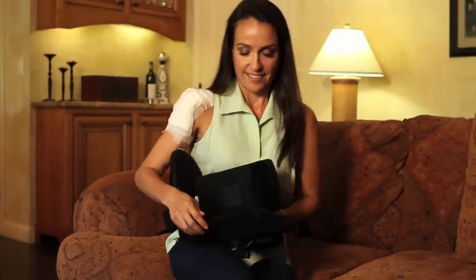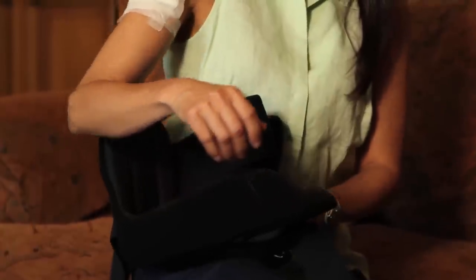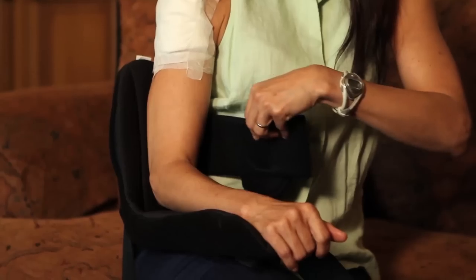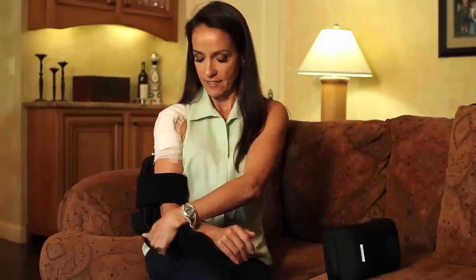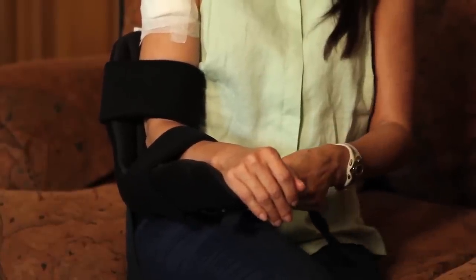The Shoulder Cradle is simple to apply. First, gently place the arm into the cradle and close the two primary straps — one for the upper arm and one for the lower arm. The wrist strap may also be applied for added security. It is completely removable and may be placed as needed.